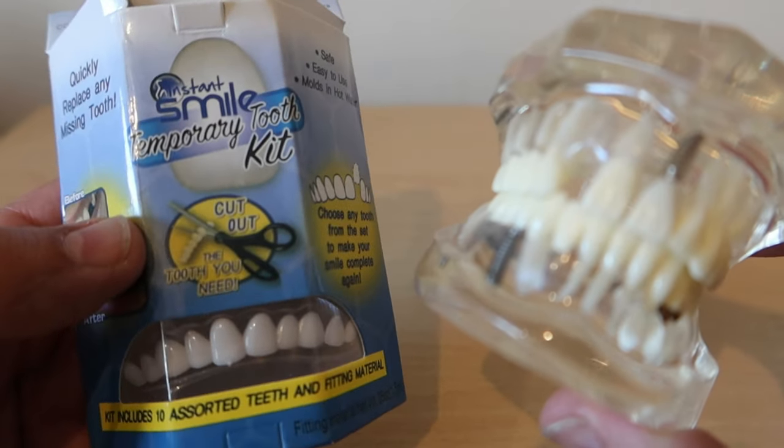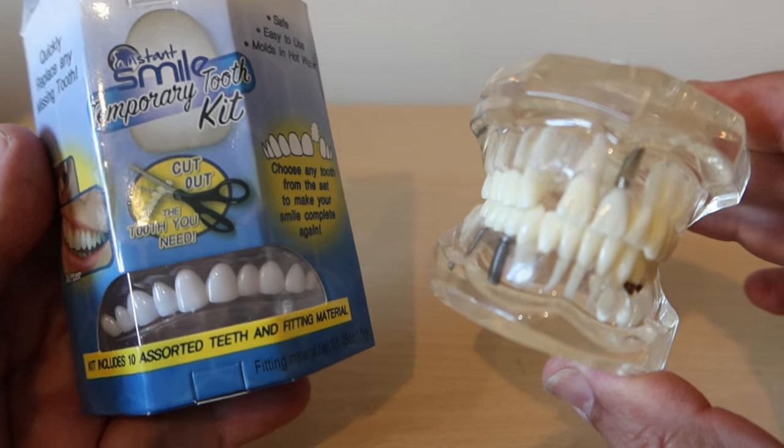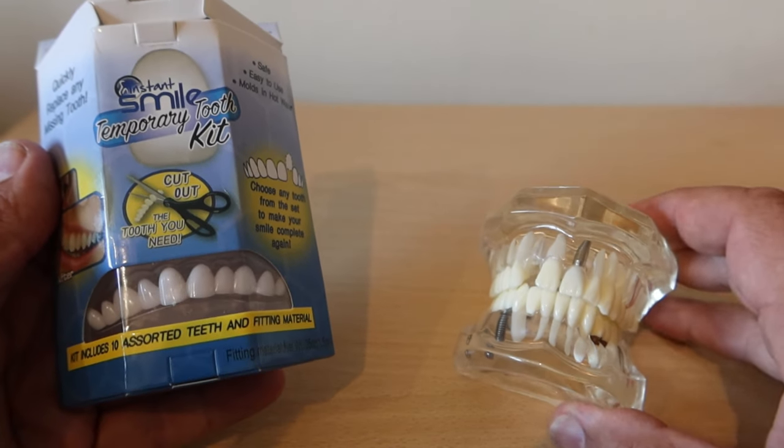If you're not able to get to your dentist then the Instasmile temporary tooth kit is going to be the answer until you can. With this cheap kit you can create a little instant repair for yourself, and that's exactly what this kit does.